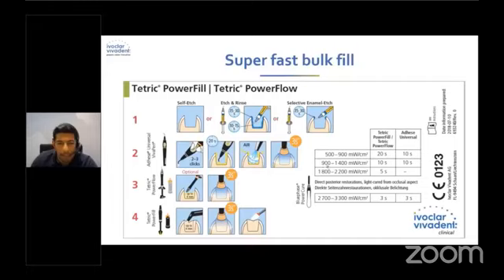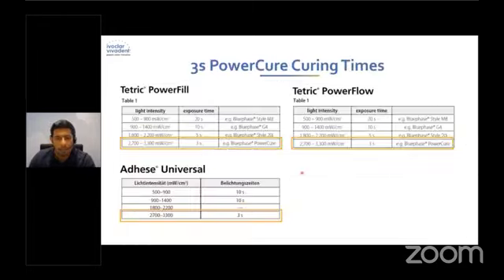However, otherwise, if you've got a normal light cure that produces about 1,000, you can still do it, but not in 3 seconds, you'll need 10 seconds, okay? So that's not an issue. But yeah, now you know that you can actually cure and make life a little bit quicker in the clinic. Right, so 3 is the magic number there.